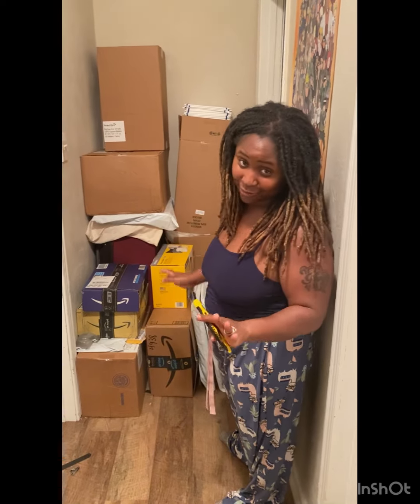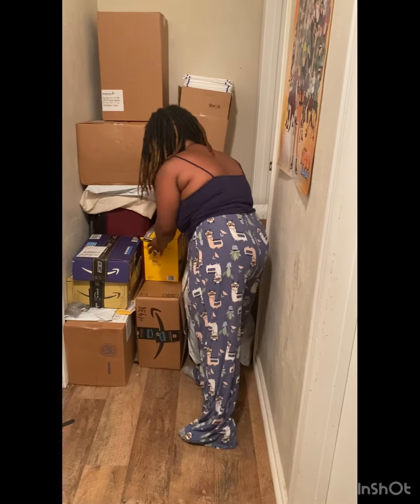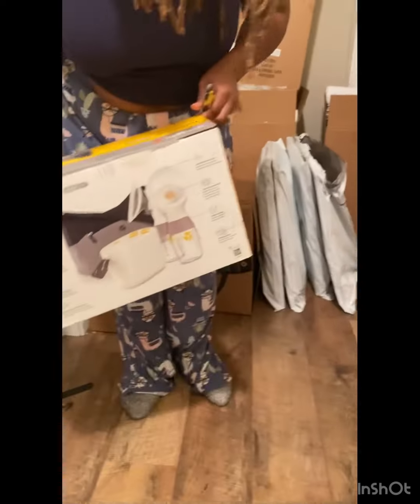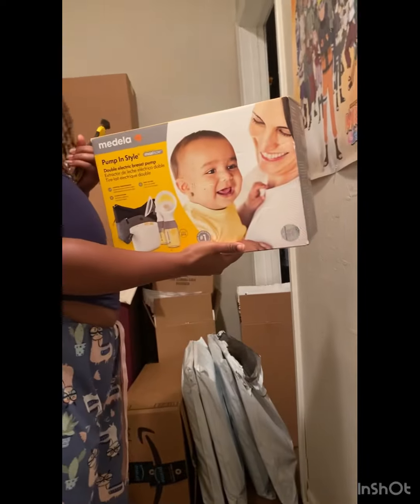So this is going to be three separate videos. With the first video, I'm going to be unboxing my new package, my Medela. Y'all, so you know I breastfeed, right? But anyways, I ordered this Medela. It's called Medela Pumping Style Max Flow.